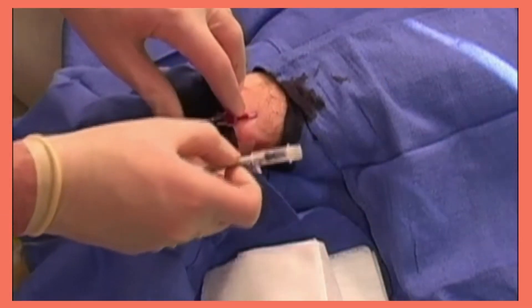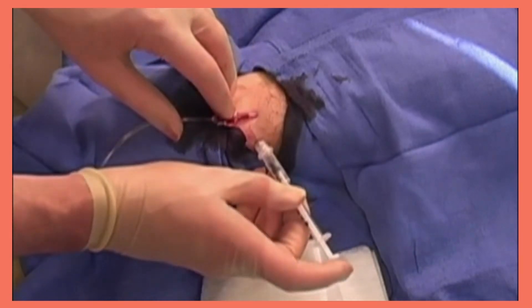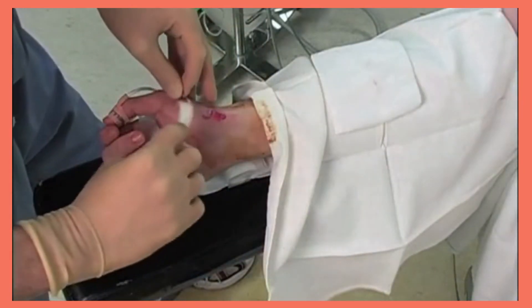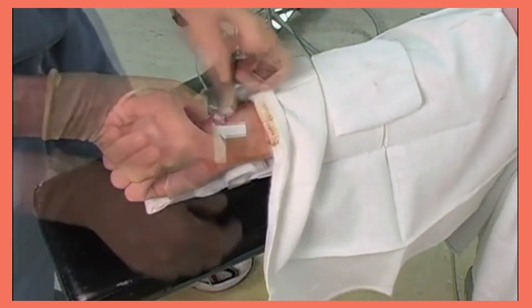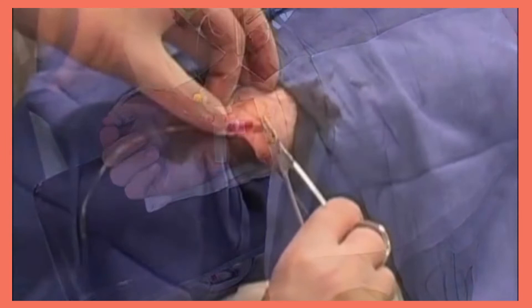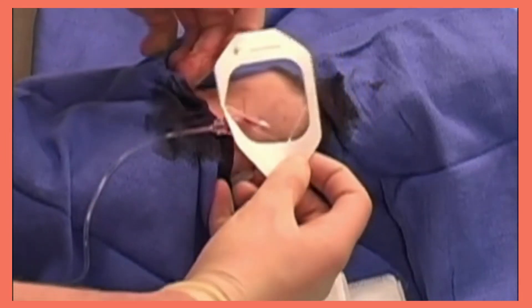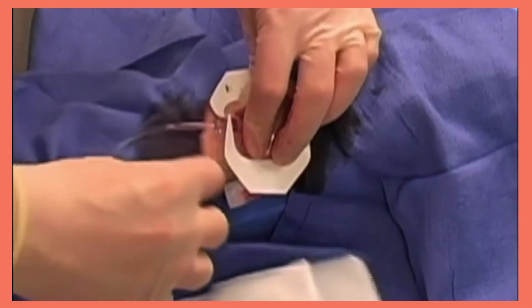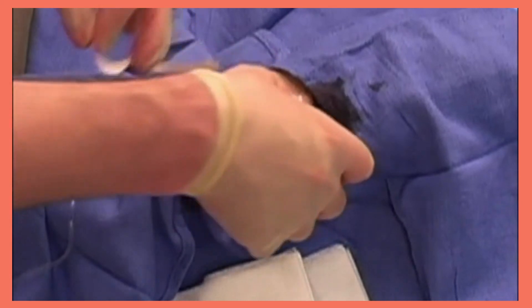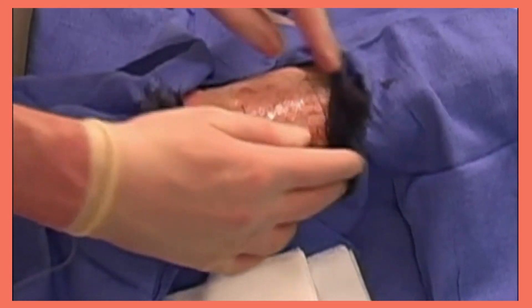Regardless of the technique used, great care should be taken to make sure the catheter stays in place. Although there are ways to secure the catheter with adhesive tape, the best way is by suturing it in place. A moderate diameter, non-absorbable suture material such as silk or nylon should be used. A clear dressing can then be placed over the catheter to help further secure it.